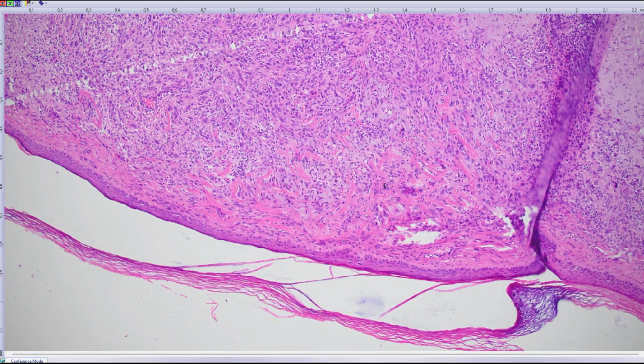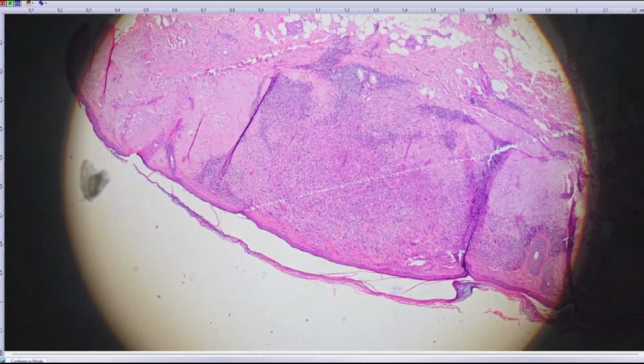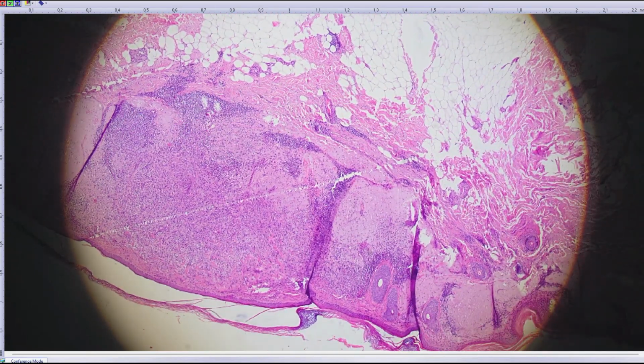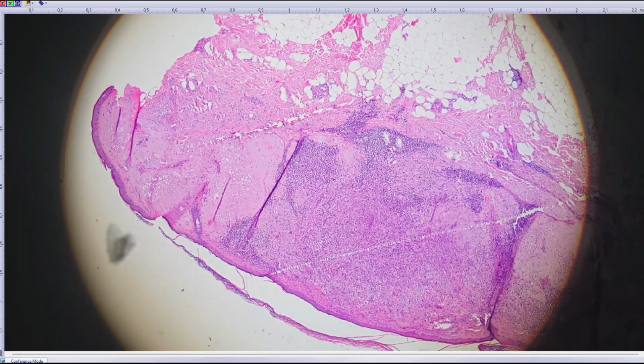The methylation studies have shown that sarcomatoid squamous cell carcinoma and atypical fibroxanthoma have very similar, overlapping methylation profiles, so it's probably a variant of the same thing. But these so-called atypical fibroxanthomas are nothing else but sarcomatoid carcinomas as well, those having dysplasia in the epidermis.